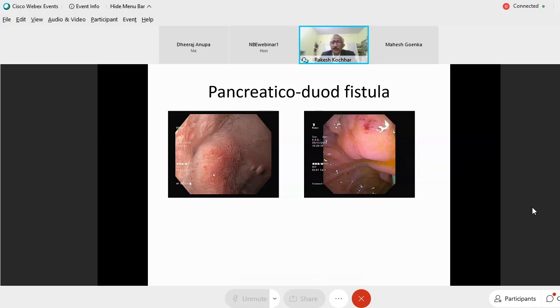This was a patient of acute pancreatitis. Now, this patient had GI bleeding some time back, upper GI bleed, no lesion found. When we went in, we found this abnormal mucosal pattern, which was just heightened villi. And there was this small opening on distension, which turned out to be a pancreaticoduodenal fistula. So your examination must be, particularly in the duodenum, very thorough.